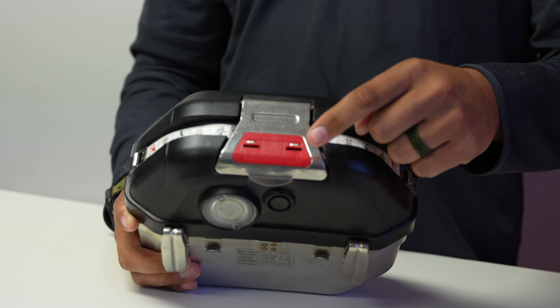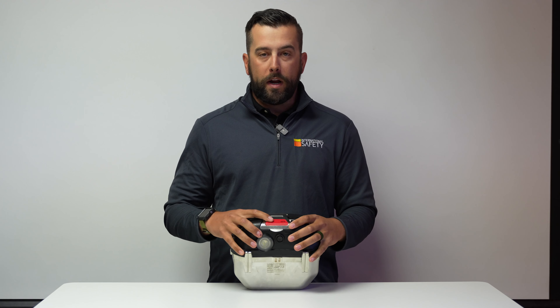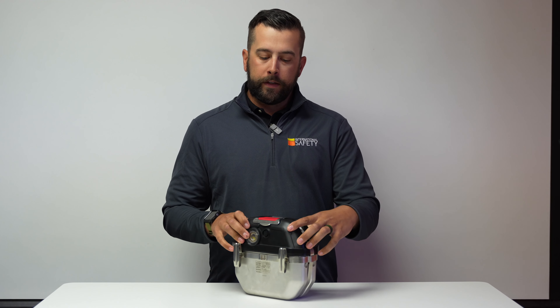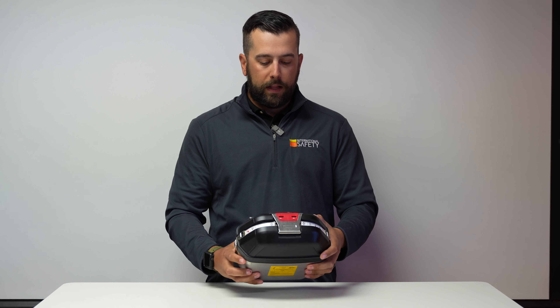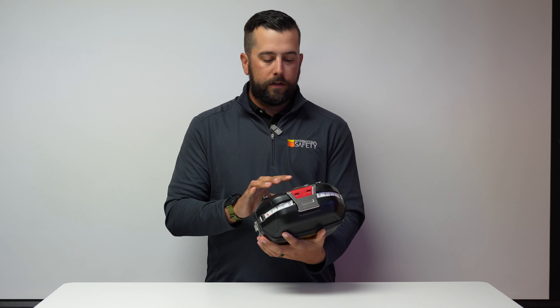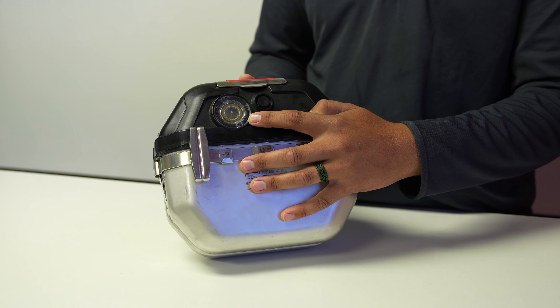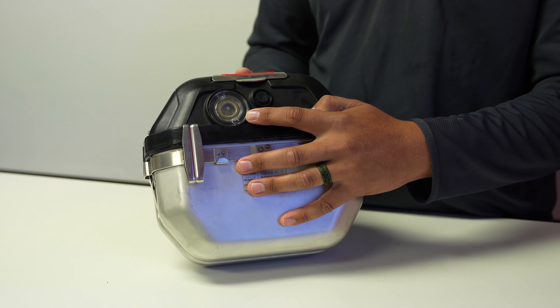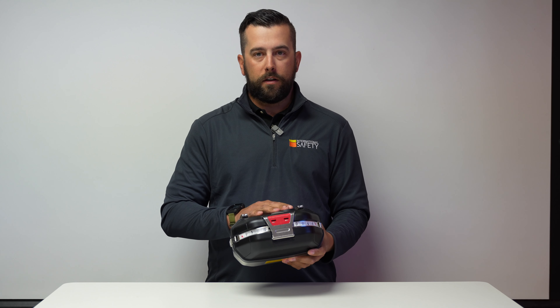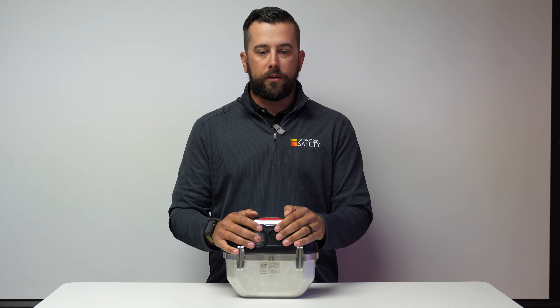Next, you're going to want to look at your red indicator — your red locking hasp right here. If you notice any signs of wear or any white marks on this, again you're going to want to have that removed from service and replaced as soon as possible. Lastly, look at your moisture indicator right here. A card that comes with your Oxy will show you that if it's brown it's still good for service, but if you have any hue of green on your moisture indicator, or you see any fragments of the moisture indicator in this clear window, you're going to want to have the Oxy either replaced or repaired before you put it back into service.